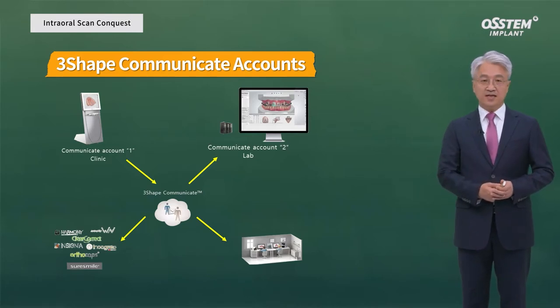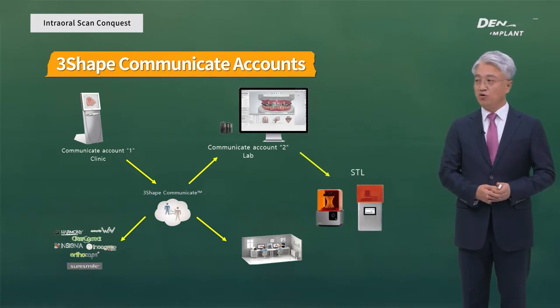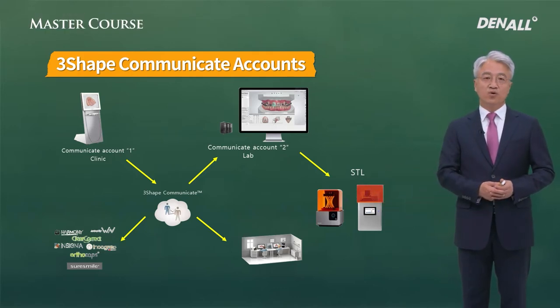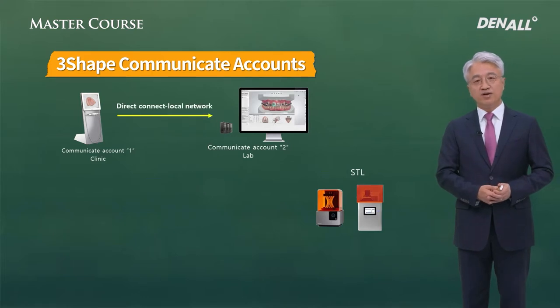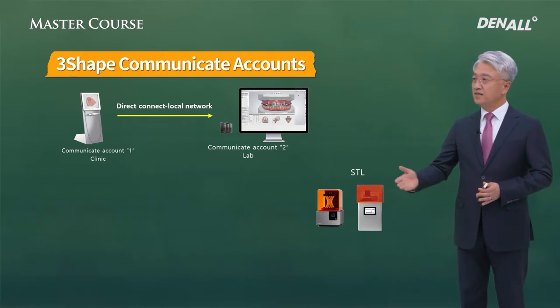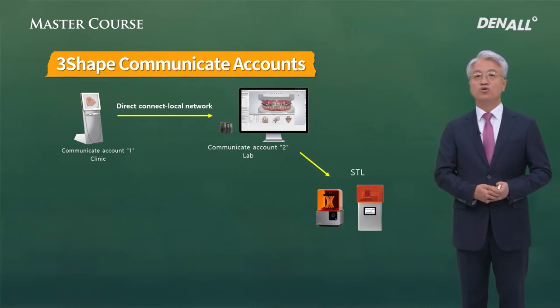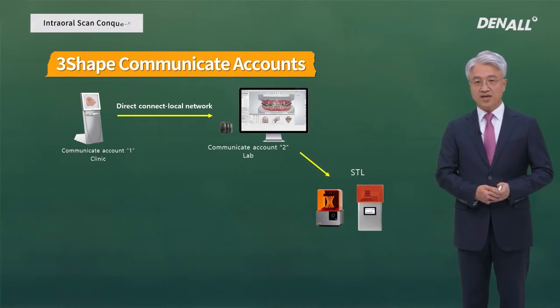You can directly send information. After you receive data using printer or milling machine, you can fabricate appliances or prosthesis. If you have a network within the dental field, you can have direct connection between the design software and scanner, and these can be fabricated. Such communication is possible.